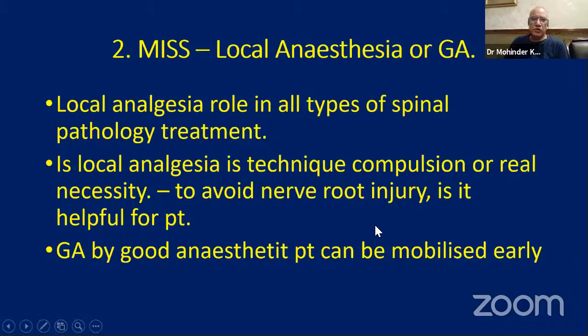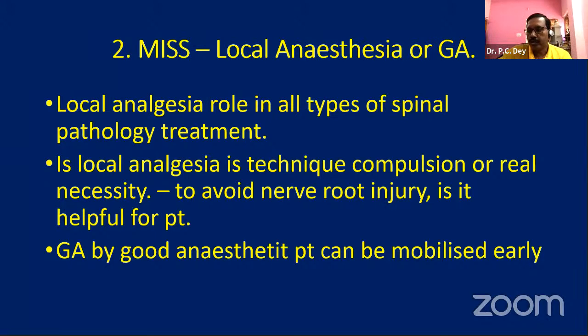If you finish the procedure in 1 hour or 1.5 hours, and most of my patients, I think now close to 1000 plus, under spinal, all patients are pretty happy, and my anesthetist is also comfortable and happy. So no issues. So during the surgery, you are showing the total surgery to the patient also. Yeah. He is conscious, watching on the monitor, and he is talking to me.